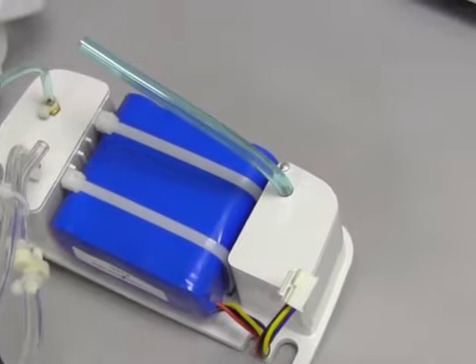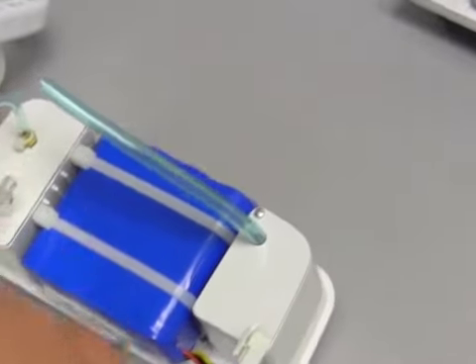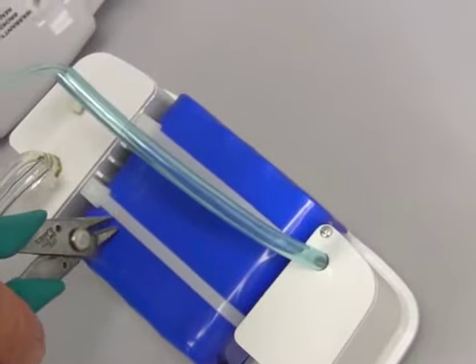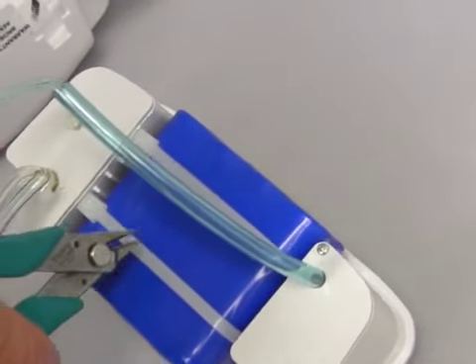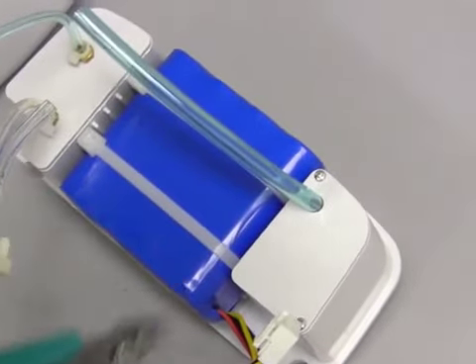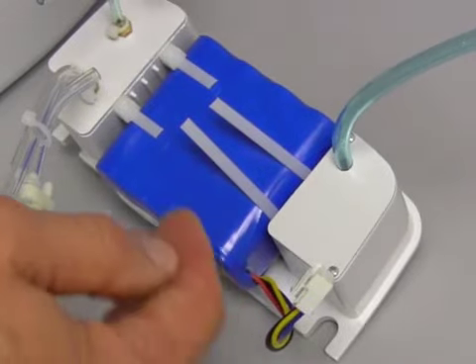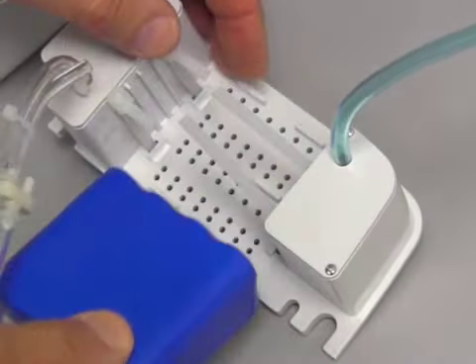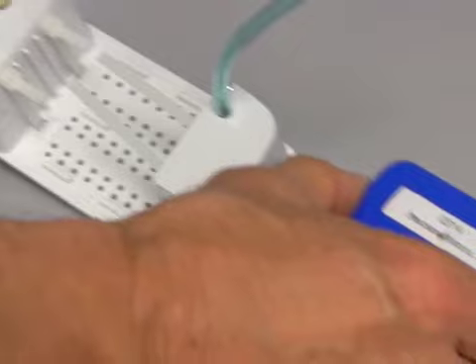With the reservoir removed, if your goal is to replace the battery, the next step would be to cut the wire ties that hold the battery in place, and then you're ready to remove the battery from the reservoir. I have now cut the wire ties that hold the battery, and the battery is now easily removed from the device.